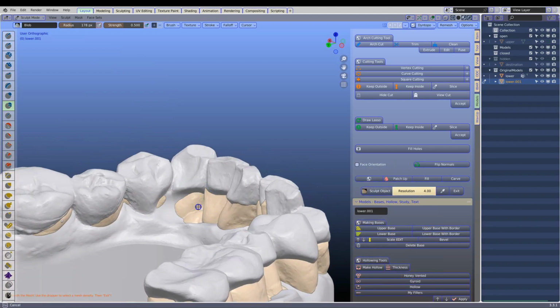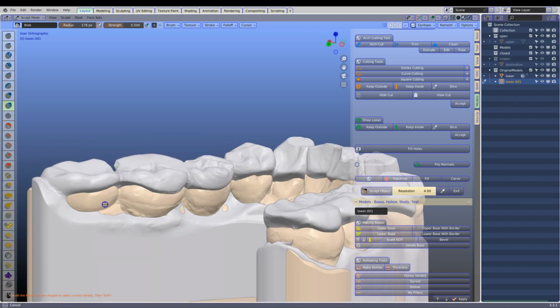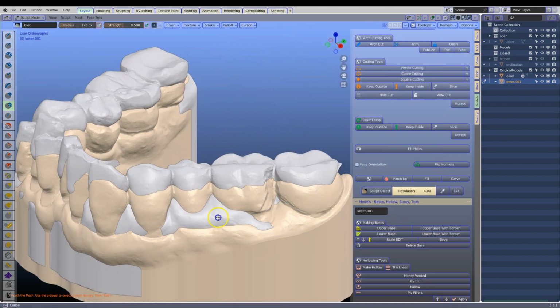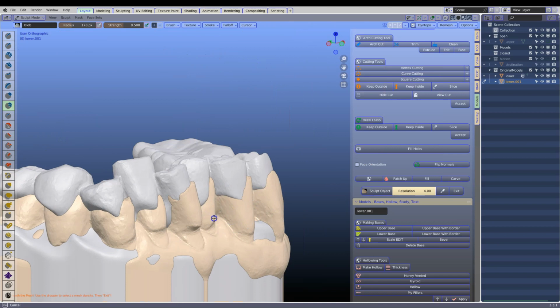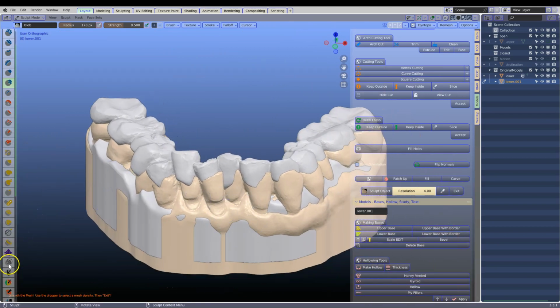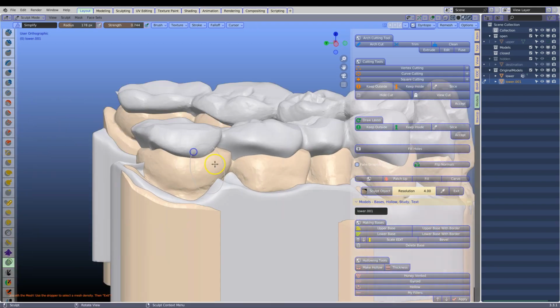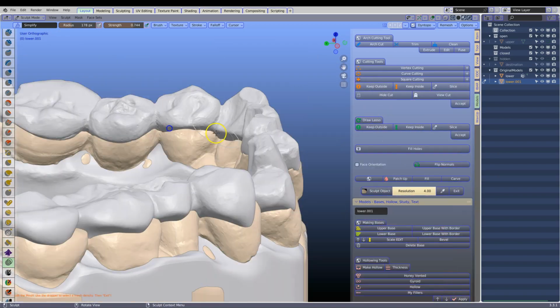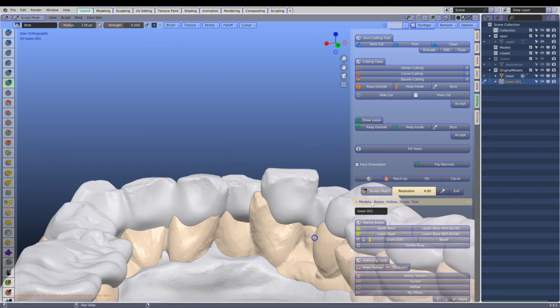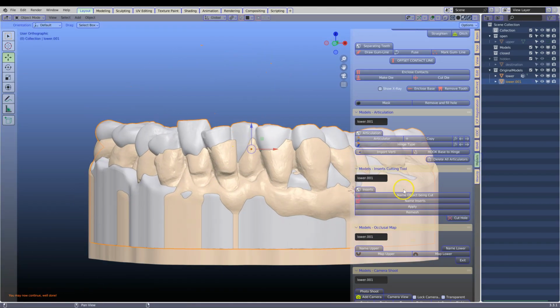Now you can imagine when we're cutting this occlusal surface, this separation has to be clear, otherwise it's not going to separate. Then I'm going to go to the simplify of the sculpting and smooth it down a little bit. When done, we need to cut the occlusal surface.